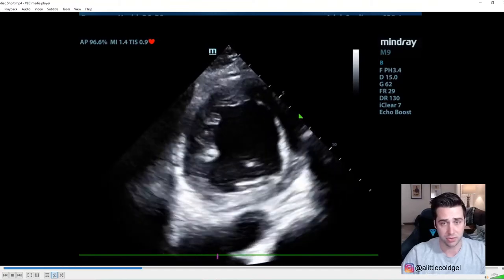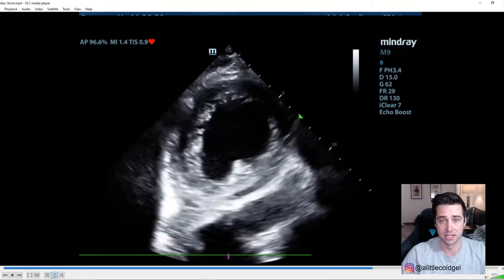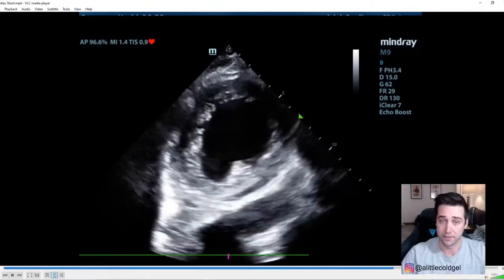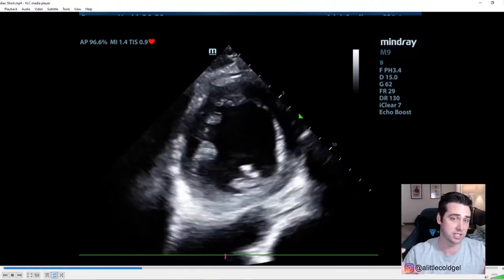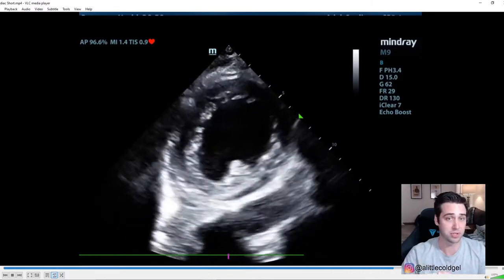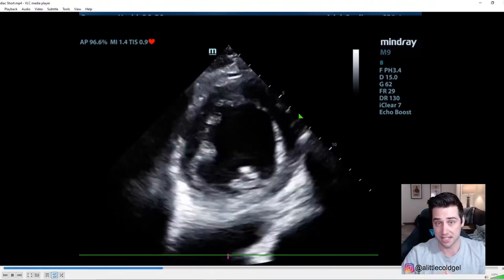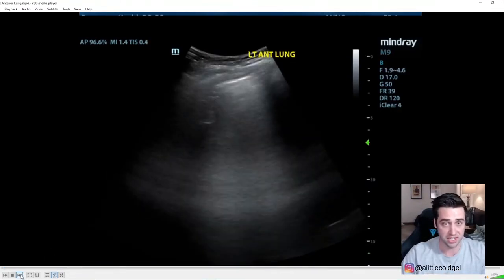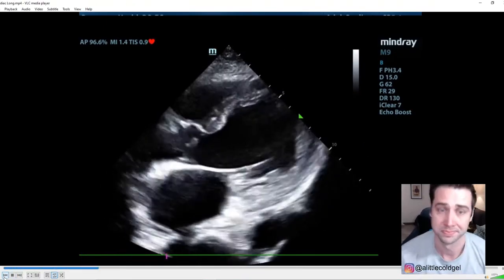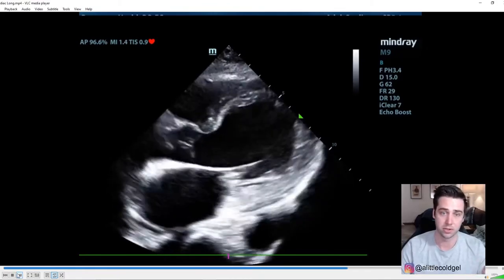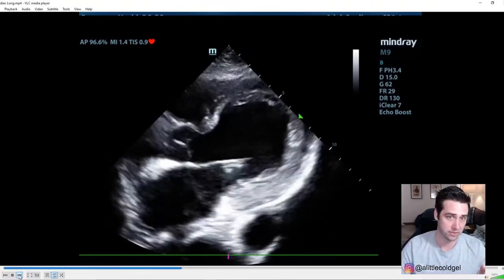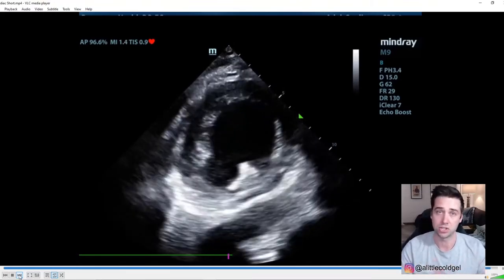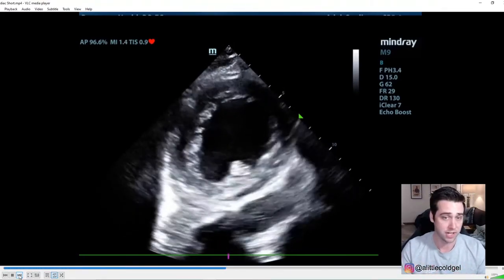A normal ejection fraction is considered greater than 55%. I teach people to evaluate ejection fraction by imagining whether that circle is closing down 55% — and looking at this heart, you can obviously say that's not the case. This is a severely reduced ejection fraction. So in this case we have a poor ejection fraction, and the clinical question is: is the patient short of breath, and is that poor ejection fraction the cause?